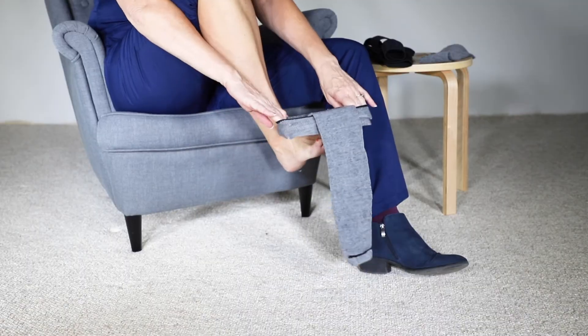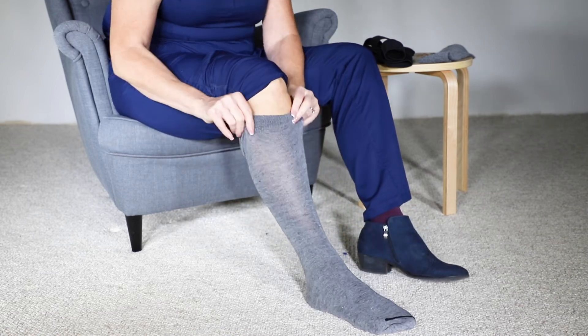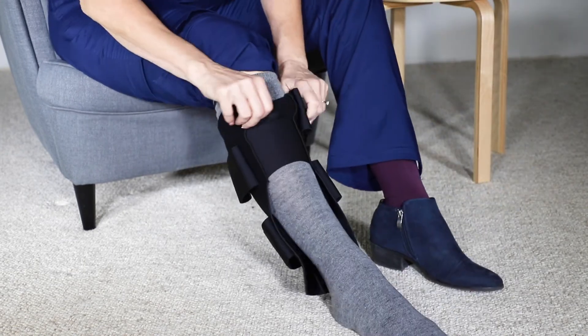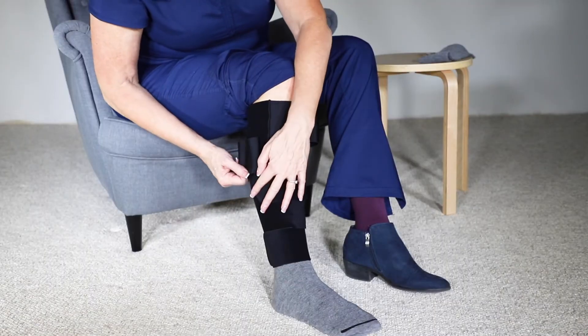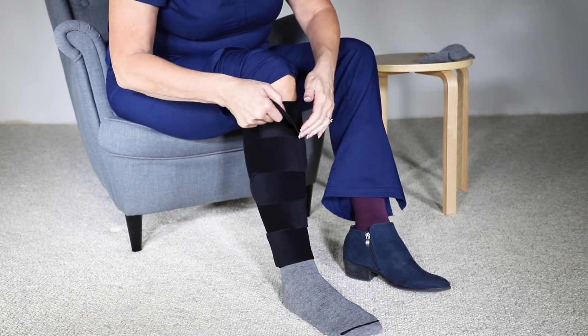Make sure your skin is clean and dry. Begin by donning one of the supplied liners with the stretch panel facing forward. Slide your leg into the wrap and pull the garment up the calf until it is roughly five centimeters or two fingers width from your knee crease. Close the straps without applying any tension, making sure that they are flat without gaps.